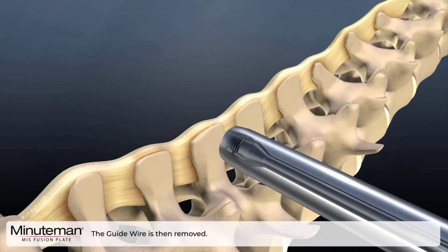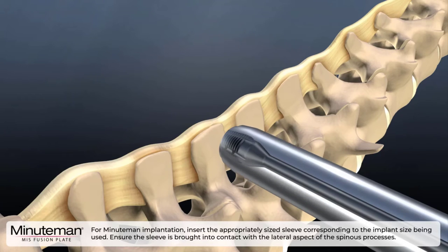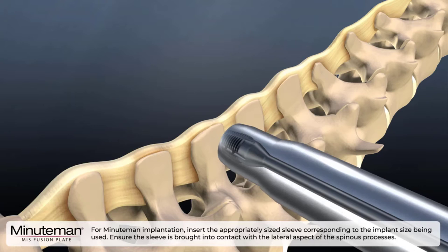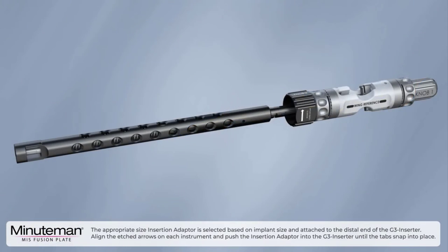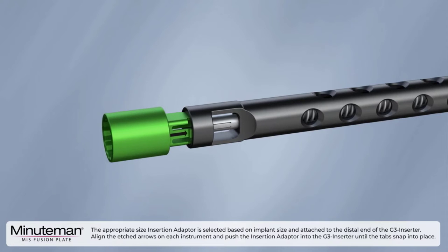For Minuteman implantation, insert the appropriately sized sleeve corresponding to the implant size being used. Ensure the sleeve is brought into contact with the lateral aspect of the spinous process. The appropriate size insertion adapter is selected based on implant size and attached to the distal end of the G3 inserter. Align the etched arrows on each instrument and push the insertion adapter into the G3 inserter until the tabs snap into place.